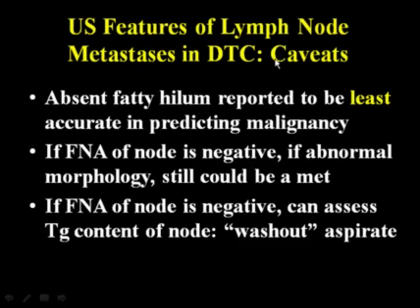So just a couple of caveats or pitfalls of nodal metastases in differentiated thyroid cancer. Just remember that the absence of the fatty hilum is actually reported to be the least accurate in predicting malignancy. If you FNA a lymph node and it comes back negative, if there's abnormal morphology, it could still be a metastasis. Sometimes you just are not able to get a good FNA specimen with accurate cytologic diagnosis.